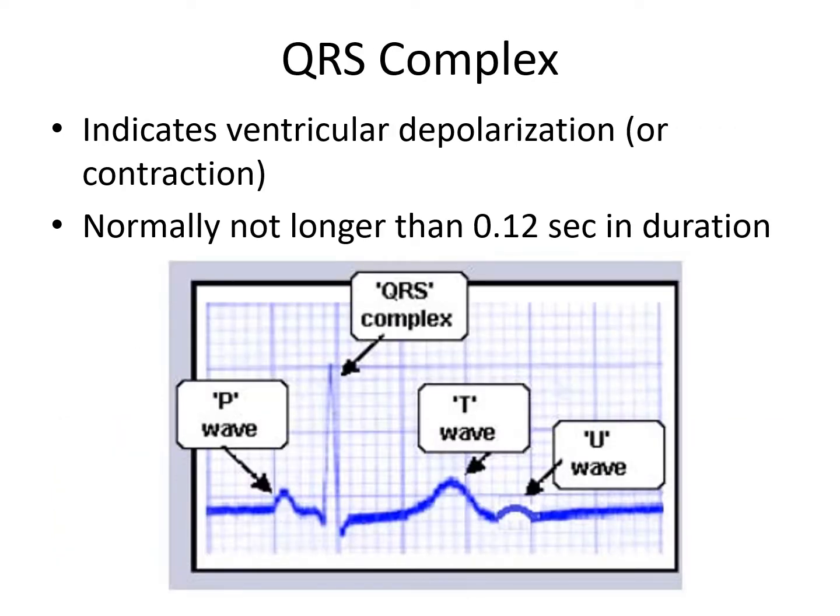The QRS complex or interval represents the time it takes for depolarization of the ventricles. Normal depolarization requires normal function of the right and left bundle branches. The QRS duration may vary with the size of the heart and is longer in the base apex lead. A block in either the right or left bundle branches delays depolarization of the ventricle, resulting in a prolonged QRS duration.